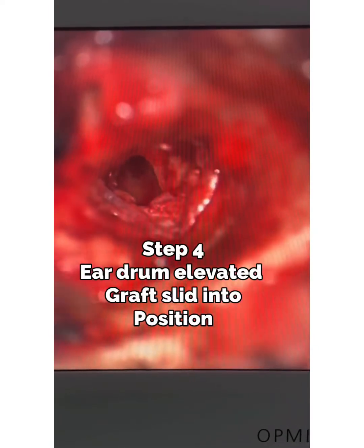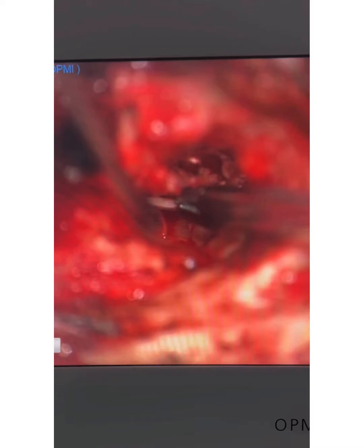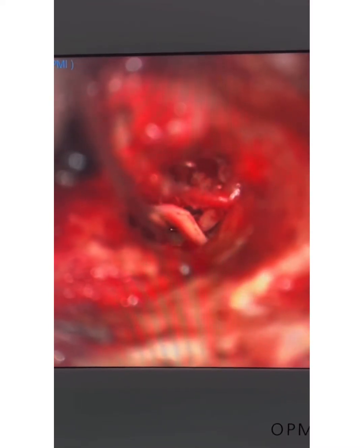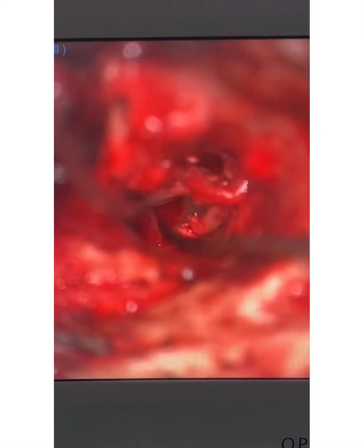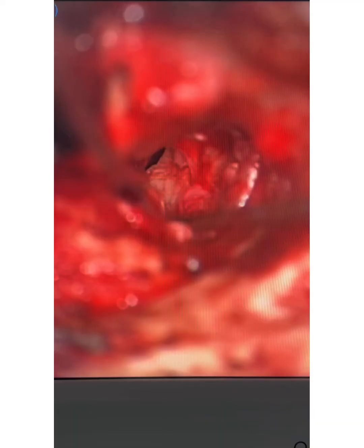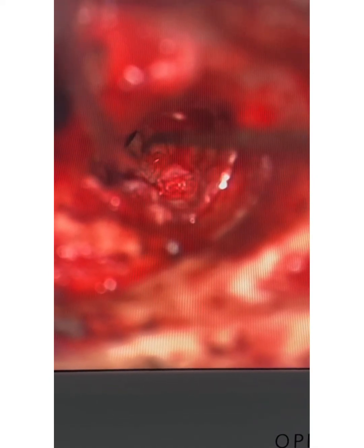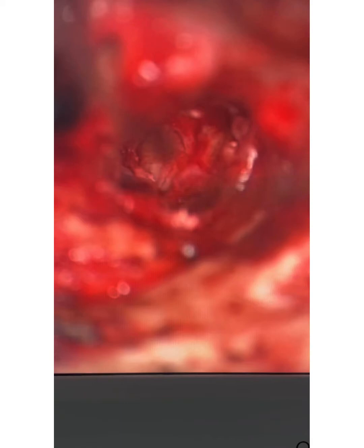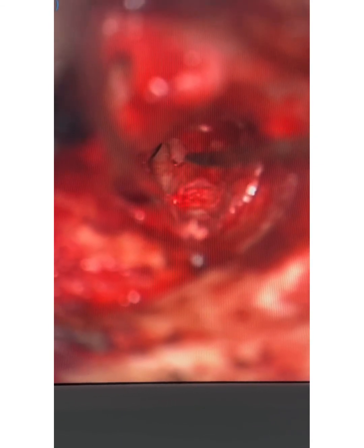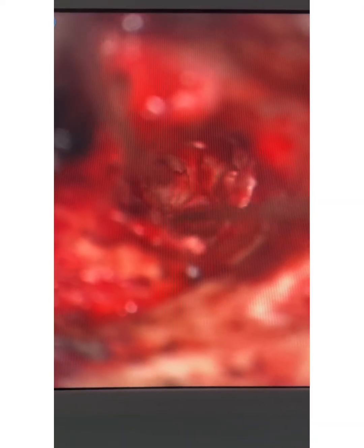For the preparation of the eardrum right here, I've lifted up the eardrum. Now I'm going to show you how we can slide the cartilage graft under the eardrum. You can see how this piece of cartilage slides in on the under surface of the eardrum and will act as a new eardrum. We're going to support it with some special gelatin sponges so that it's all the way up and stuck to the eardrum, acting as this patient's new eardrum instead of the hole they previously had. It's going to work just like a regular eardrum.